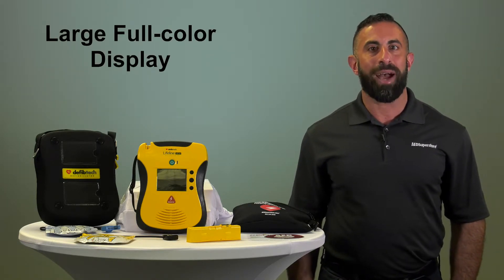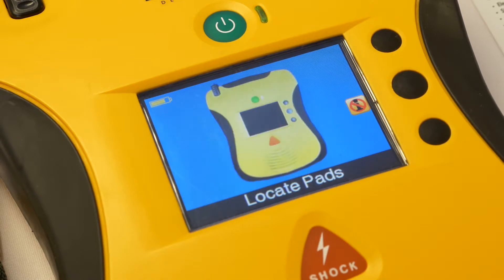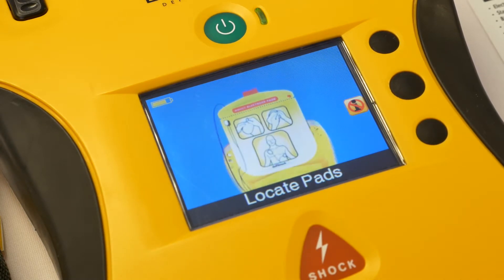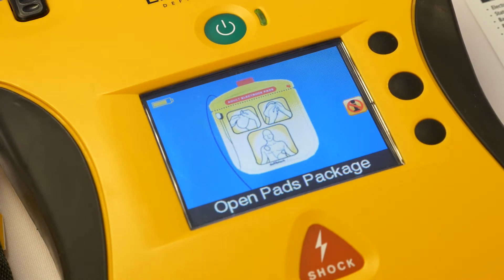A large, full-color interactive display gives you step-by-step visual and voice instructions for performing CPR, rescue breathing, and external defibrillation. Full-text prompting supplements detailed voice prompts, and a built-in metronome assists with your compression rates during CPR.